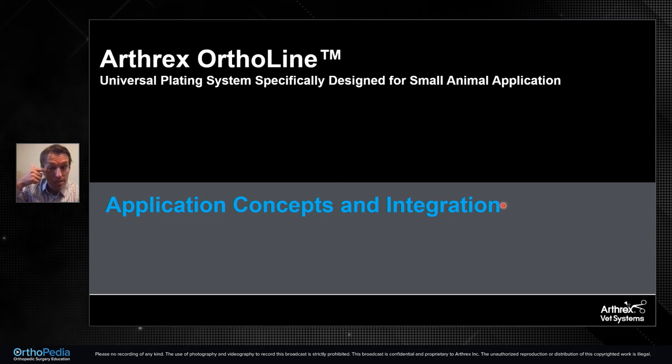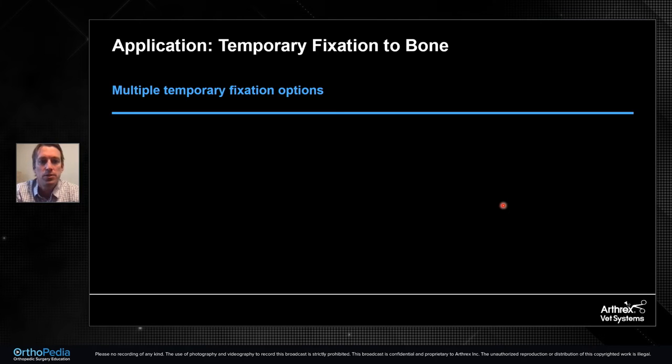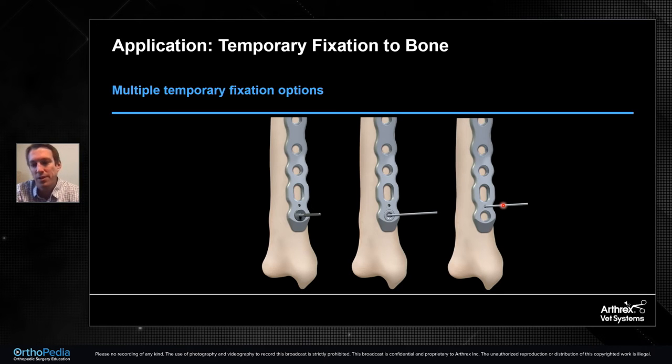So along those lines of just biomechanics, now I'd like to take that and move on to how we apply these, and how they integrate across current plating systems that Arthrex has. So certainly there are multiple temporary fixation options, and that's going to be our first step in any application of the plate to the bone. We can use a K-wire or a BB tack to fixate the plate to the bone. We can also just go straight to the slide hole.